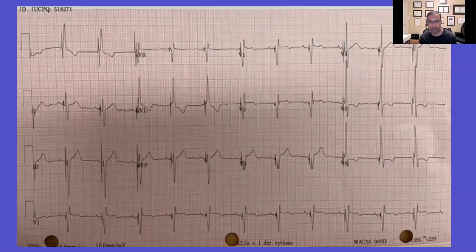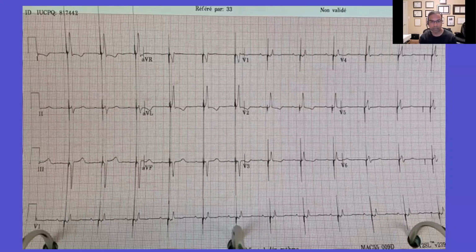I don't know what Francois specifically was going to say about this, but this looks like a fantastic left bundle pacing ECG. AVL and AVR are completely dissociated. You have a beautiful QR pattern in V1. The latency in V1 is not hugely long, probably closer to 20 milliseconds than to 30 milliseconds. But overall, a very nice ECG.